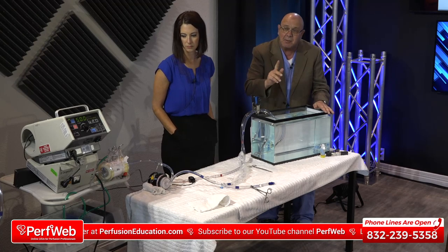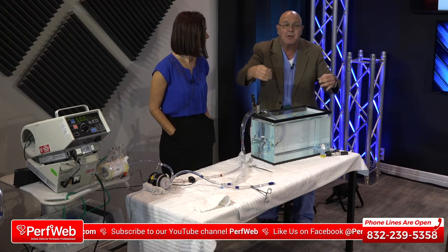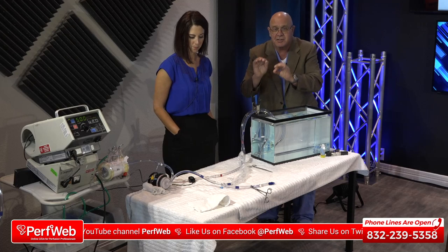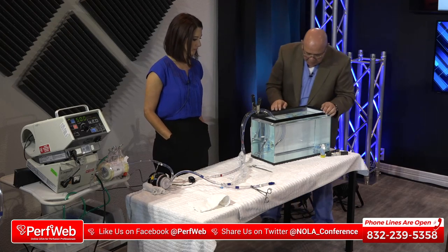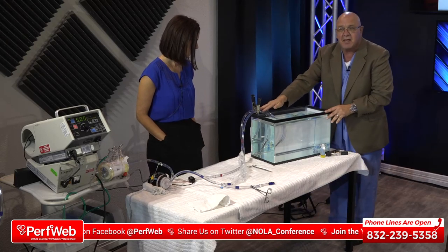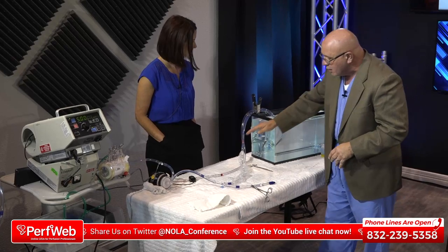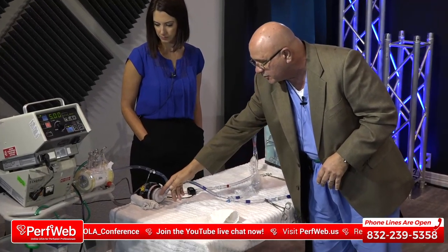But they put them on VA ECMO with my ECMO circuit. So this is the PERT team ECMO circuit that I've designed. And here, let me take you through it. So we're cannulated fem-fem, femoral venous, femoral arterial. As you can see here, you have the inflow coming through here, going into the centrifugal cone.